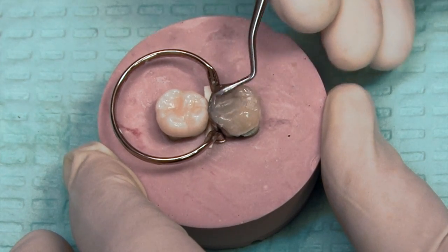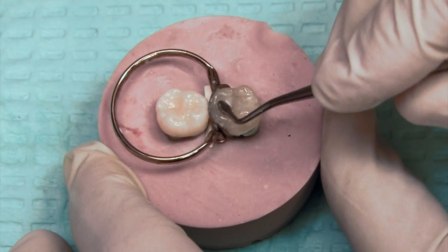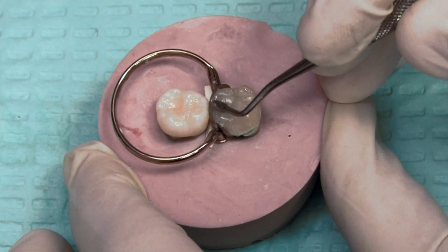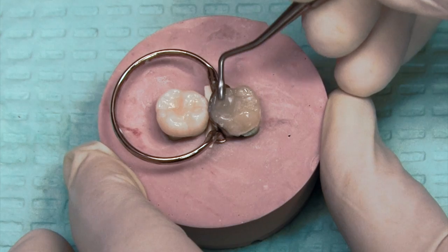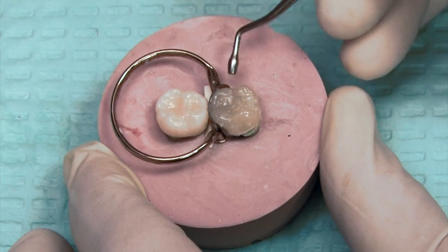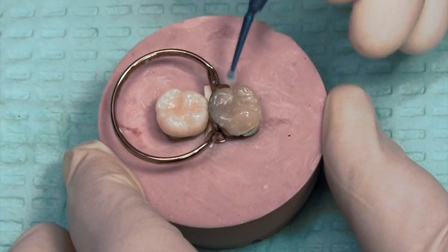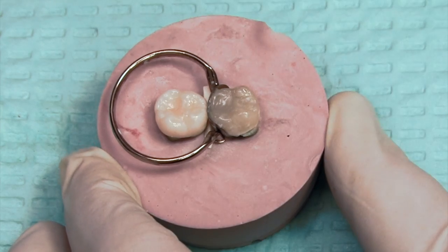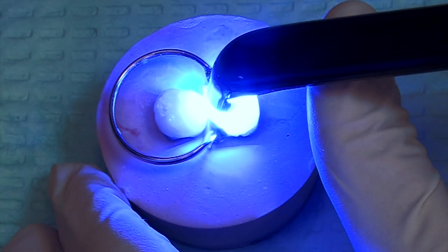Here's the last increment going into place, making sure it adapts well up to the marginal ridge and to the other increment that was just placed. Trying to form the pits and grooves, making sure it goes up the cuspal inclines, and just trying to get the initial shape together. As an optional step, you can take that brush with a little bit of bonding agent on it and go through to make sure all the occlusal surface margins are well sealed. Final cure.